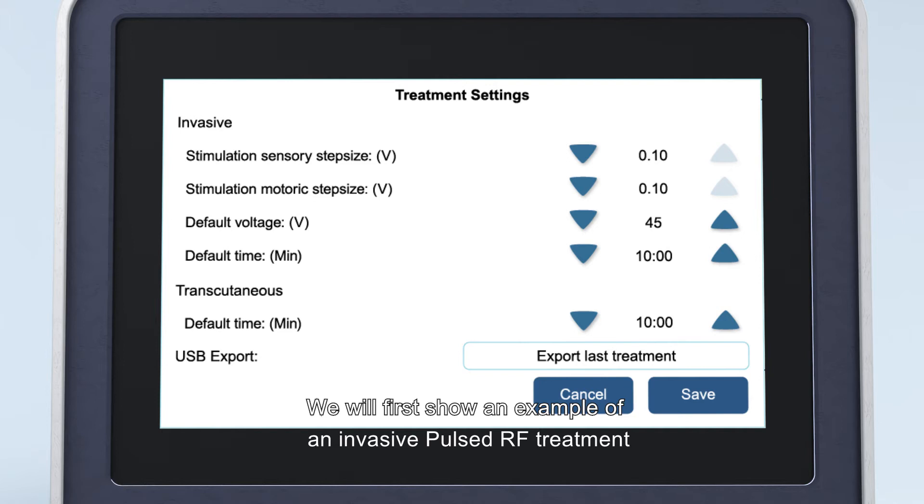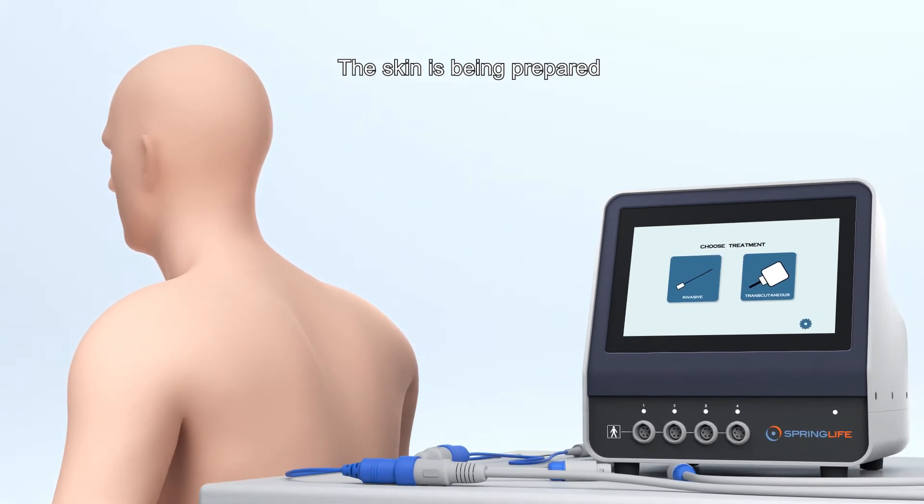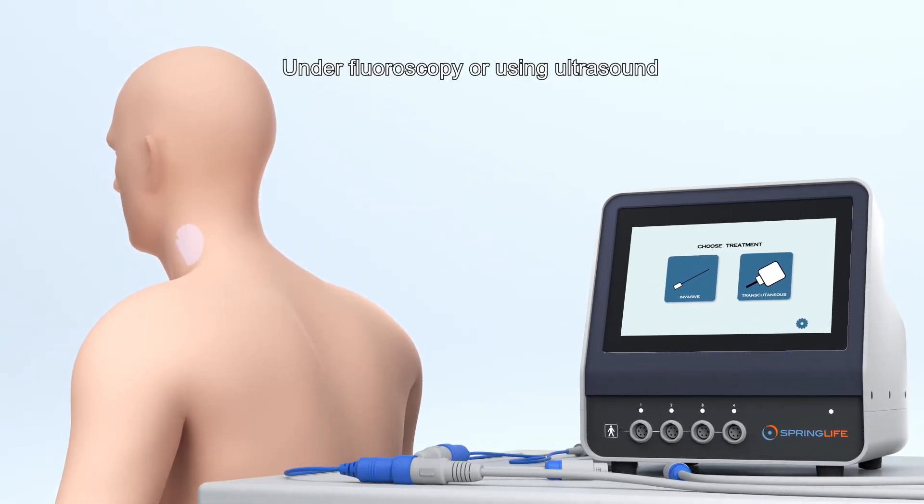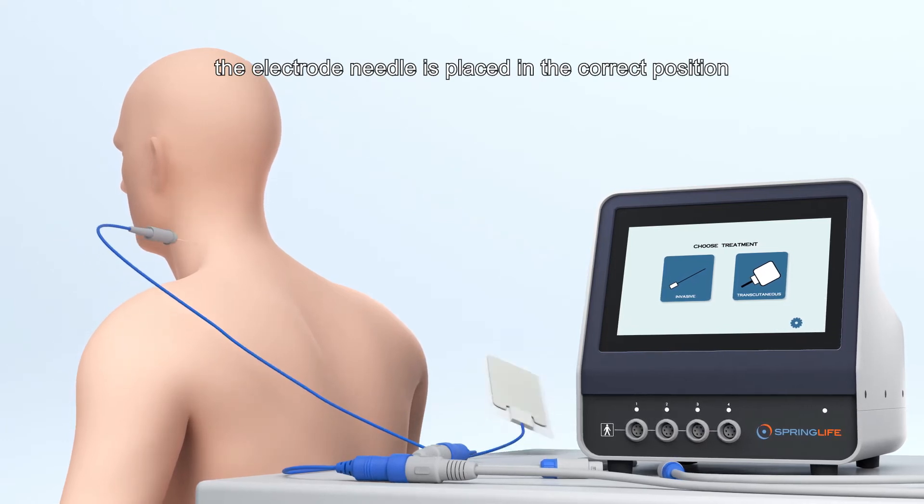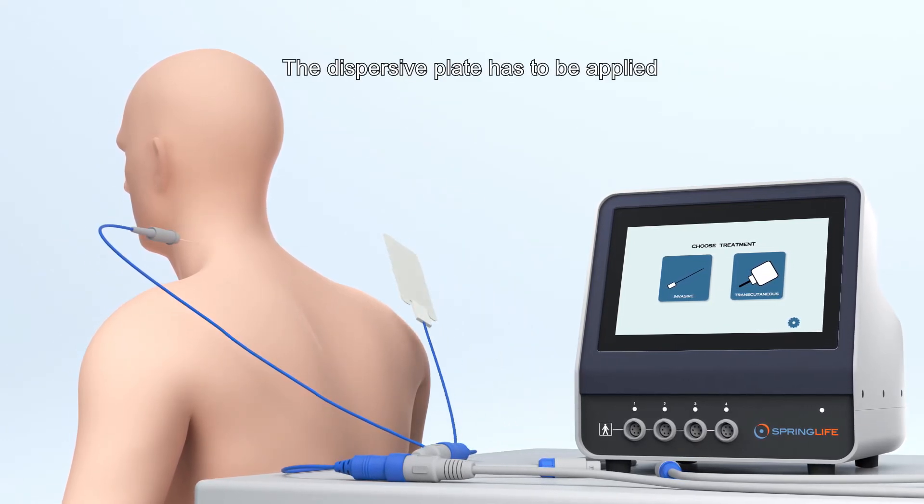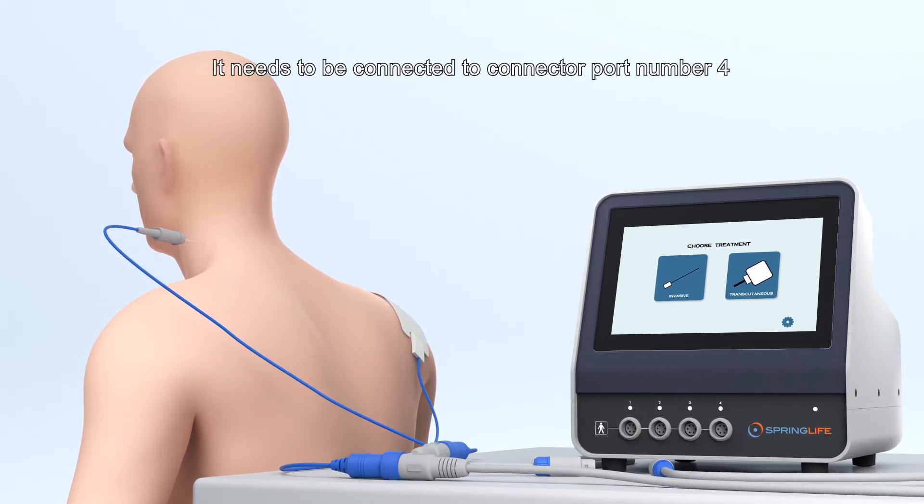We will first show an example of an invasive pulsed RF treatment. The skin is being prepared. Under fluoroscopy or using ultrasound, the electrode needle is placed in the correct position. The dispersive plate has to be applied. It needs to be connected to connector port number 4.